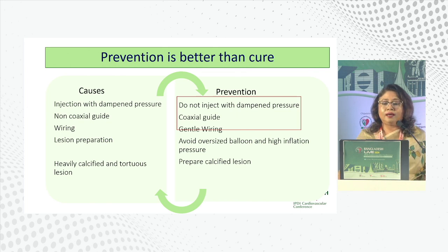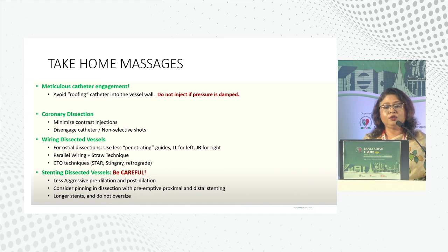So do not inject when the pressure is damped. The guide wire should be coaxial and the wiring should be gentle. For lesion preparation, avoid oversizing the balloon and high inflation pressure. Prepare for heavily calcified and tortuous lesions. Prepare the calcified lesions. So, take-home message.